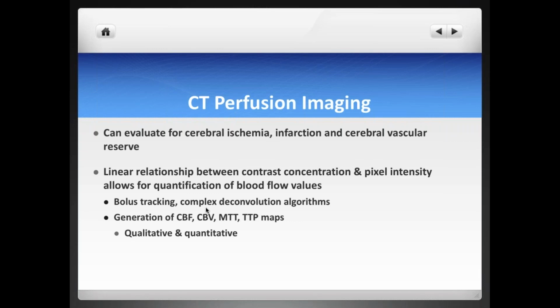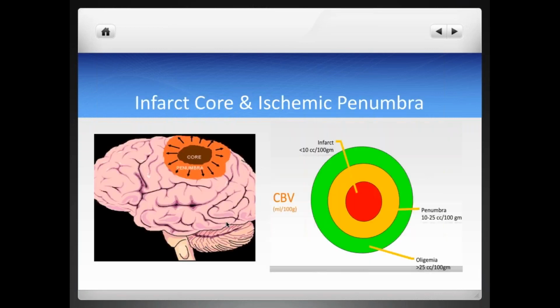Basically, CT perfusion relies on bolus tracking, and after you track that bolus, it relies on a very complex deconvolution algorithm. When I say complex, I mean complex mathematical equations that clearly are beyond my own understanding. And basically, this software generates different maps, including cerebral blood flow, cerebral blood volume, the mean transit time, and the time to peak. And with those maps in hand, you, as the imager or as the interventionalist, can then make your determination whether there is a large penumbra, if there's a mismatch between the penumbra and the core, and so on.